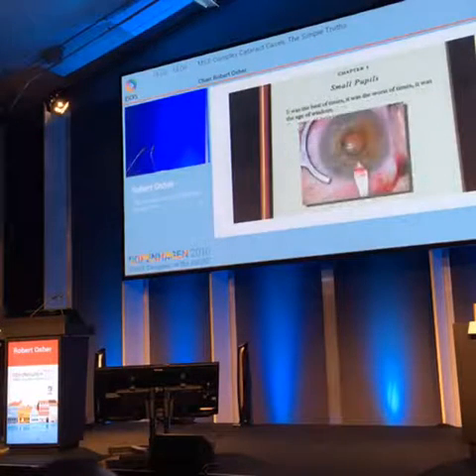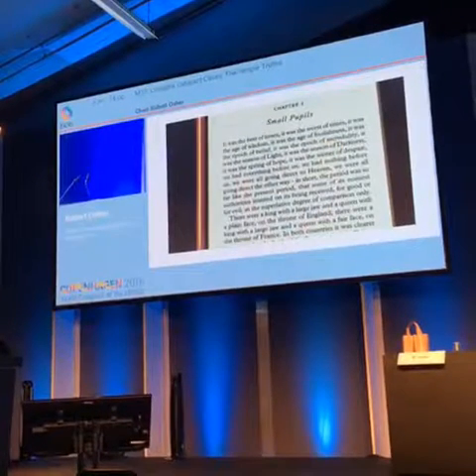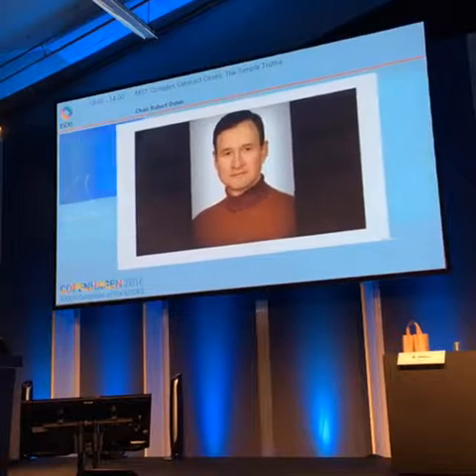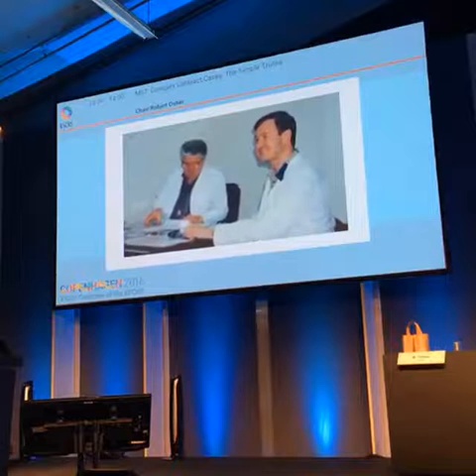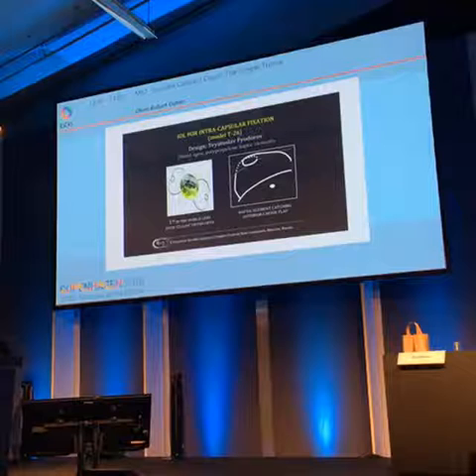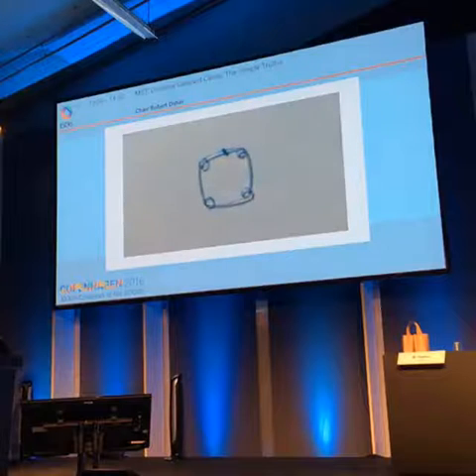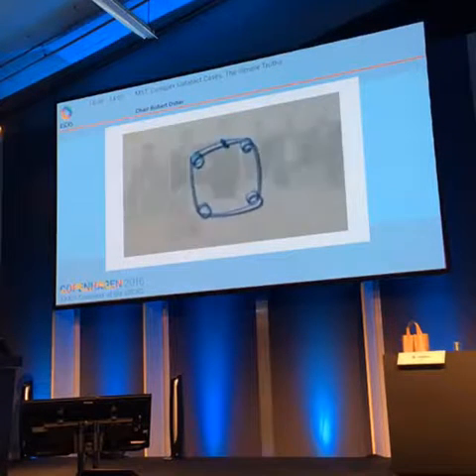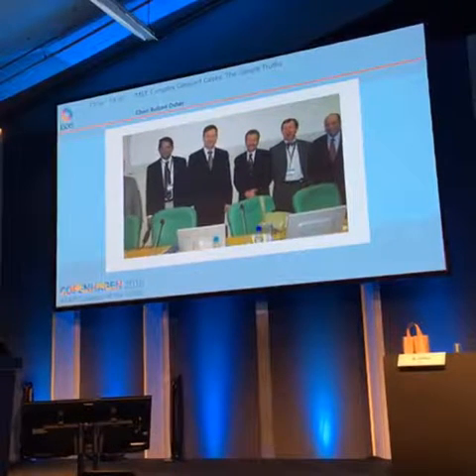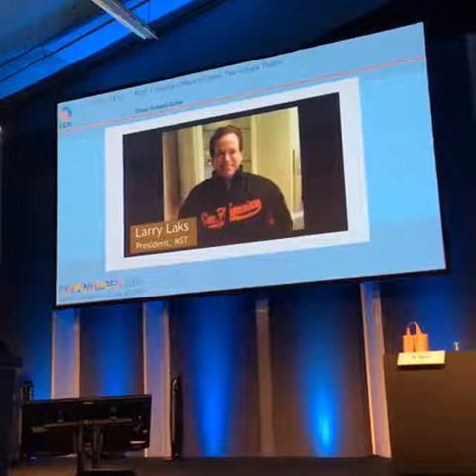It was the best of times. It was the worst of times. It was the age of wisdom when a young Russian surgeon, Dr. Boris Malugin, trained by the renowned Professor Slava Fedorov, transformed the capsular capturing principle of a Soviet intraocular lens into a tissue capturing iris retractor. Dr. Malugin showed his brilliant idea to a young American surgeon visiting Moscow in 2005, and the inventor was encouraged to find an entrepreneurial partner to manufacture and commercialize the ring.